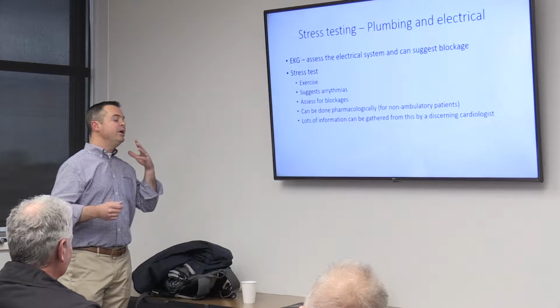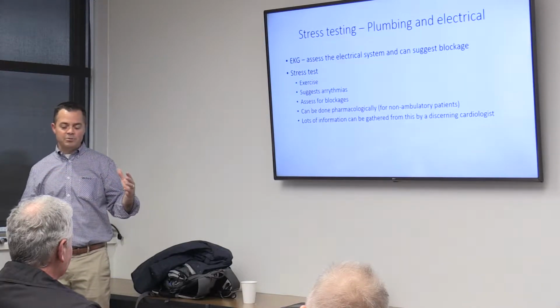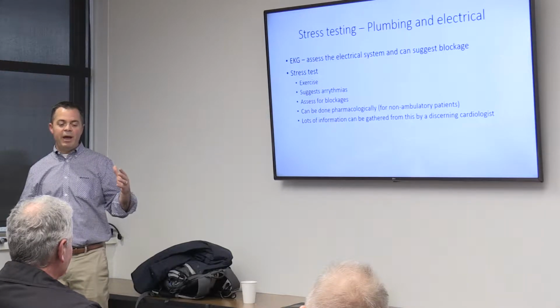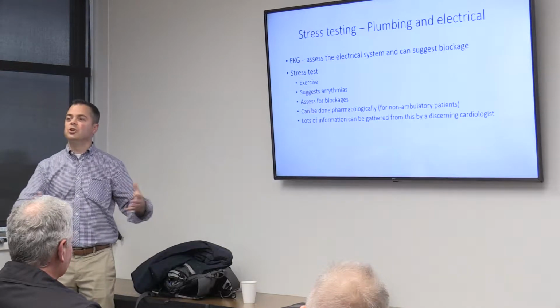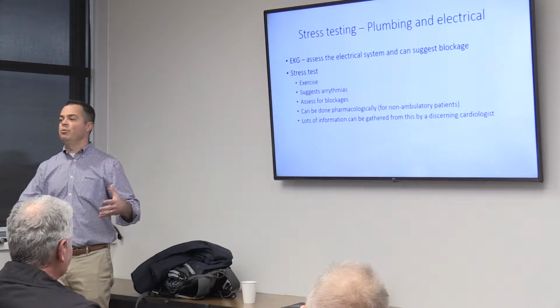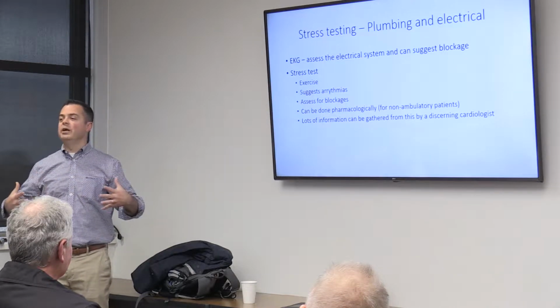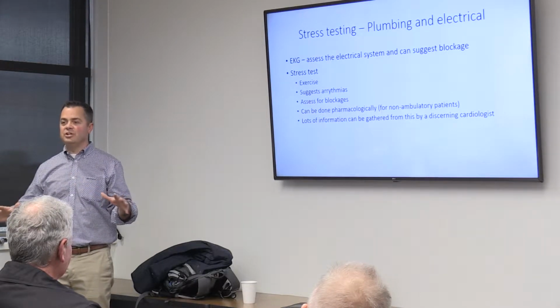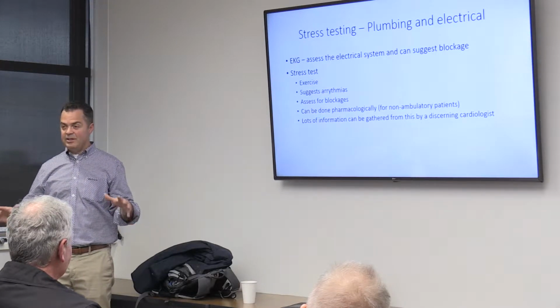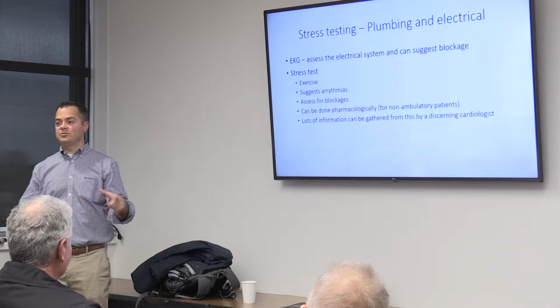And when we look at a stress test, I've said this to some of you who have worked with me, and we get it back. The test is over. You exercised as far as you could. You did as much as you could. We monitored your blood pressure, your EKG, and your heart rate. And how did you feel? How far did you go? There are buckets of information in that, tons, that gets lost because people just look at the highlights. They don't look at all the details in the stress test.